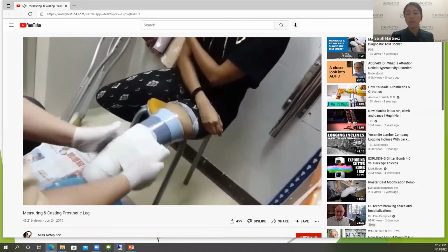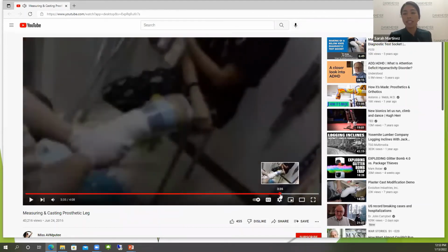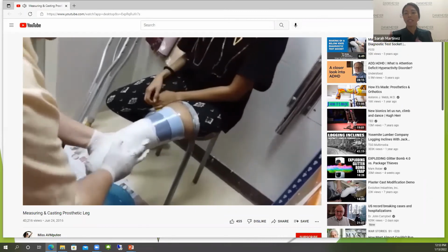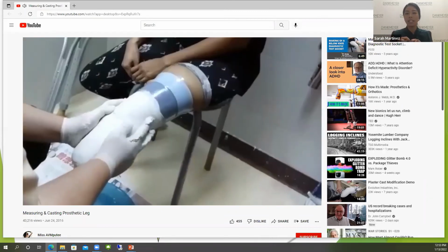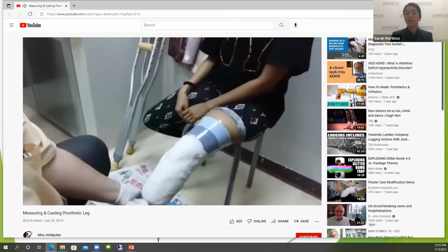And then, Angie, if you can move the cursor up to 340. That's going to take us to the tail end of this, where the prosthetist is finding some pressure tolerant and intolerant areas. The pressure tolerant area being the mid-patellar tendon.